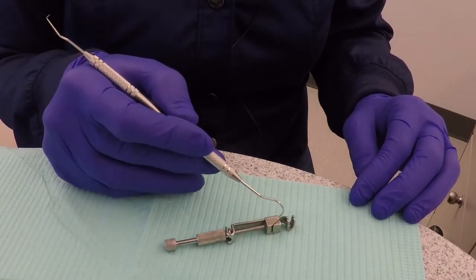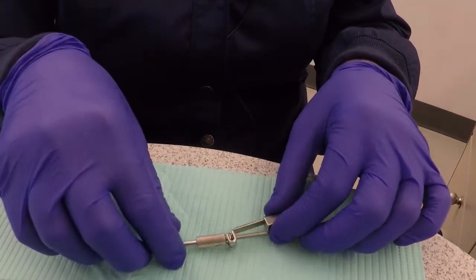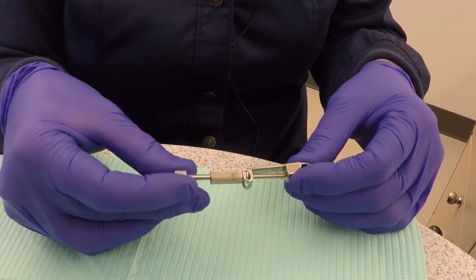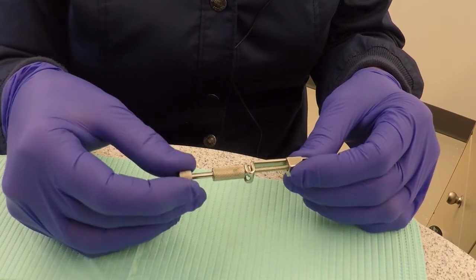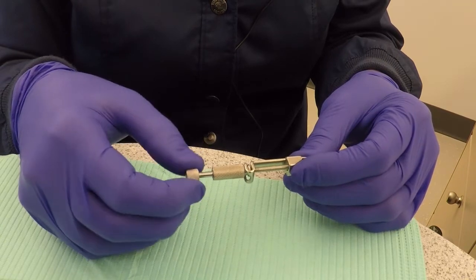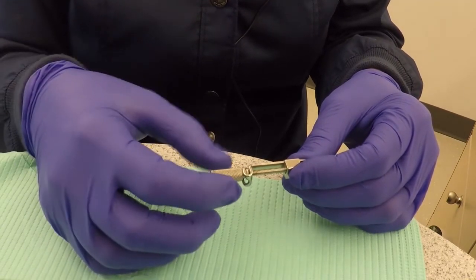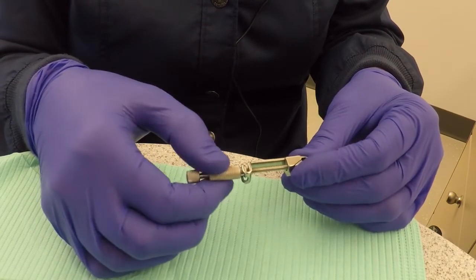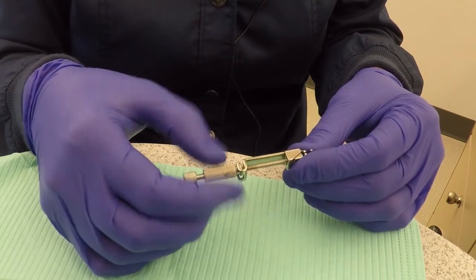Hold the retainer so that the diagonal line slot is visible. Turn the outer knob clockwise until the end of the spindle is inside the vise. Then turn the inner knob counter-clockwise until the vise is moved up next to the guide slots and the retainer is ready to receive the matrix band.